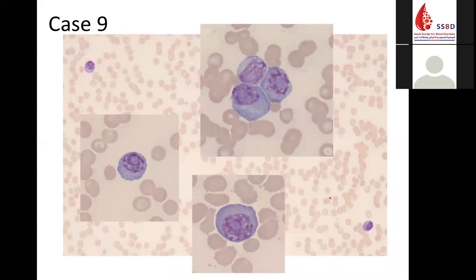24-something percent. And you can see here, plasma cells are easy sometimes and very difficult other times. You have the blue cytoplasm, the Golgi hof, the eccentric nucleus. In this case, these are immature plasma cells because of the nucleus and because of the prominent nucleoli. Usually as the plasma cells go mature, they acquire more abundant cytoplasm. They become larger in size and the chromatin will be more condensed. So these are not plasmablasts, but they are not the very nice mature plasma cells.